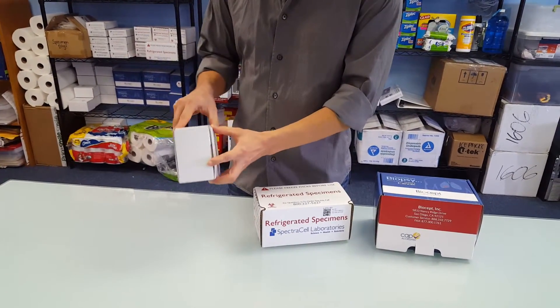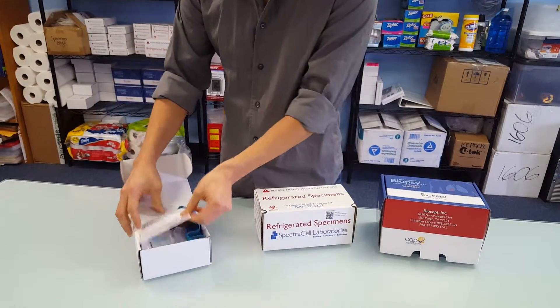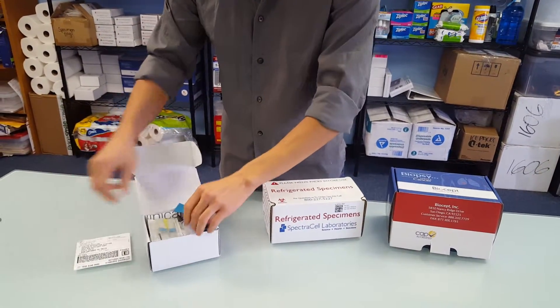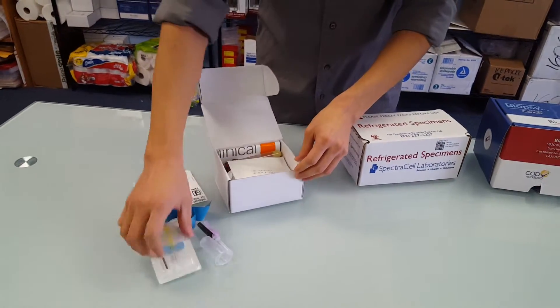Here we have a small blood collection kit. Comes in a very small box. It's pre-loaded with the return label. It's got a tourniquet, the needle, the tube holder, and a butterfly.